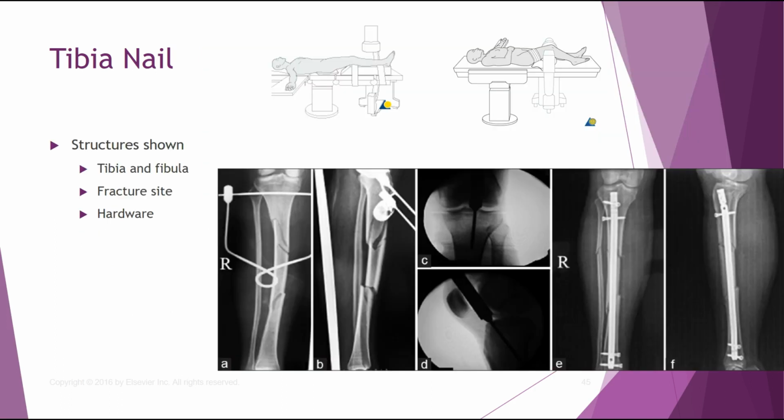All right, tibial nailings. These are some pictures of tibial nailings. Okay, C-arm pictures in the middle and regular radiographs on the edges there.